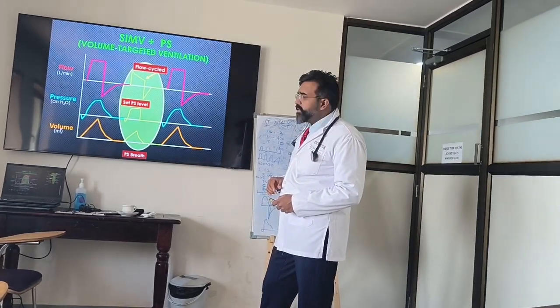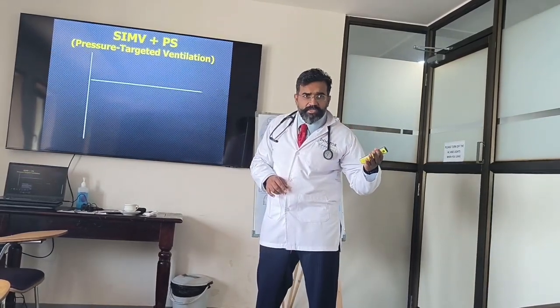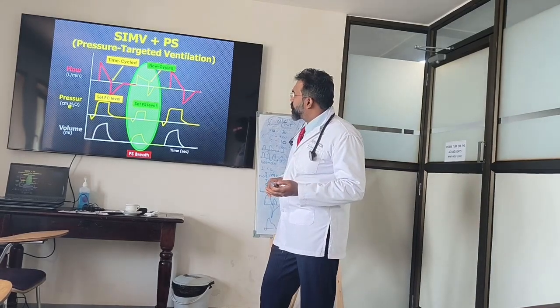So that's a flow cycle, right? Volume is going with constant pressure. So next time when you are looking at a ventilator, look at it. Understand what that is. Okay, flow cycle, time cycle.